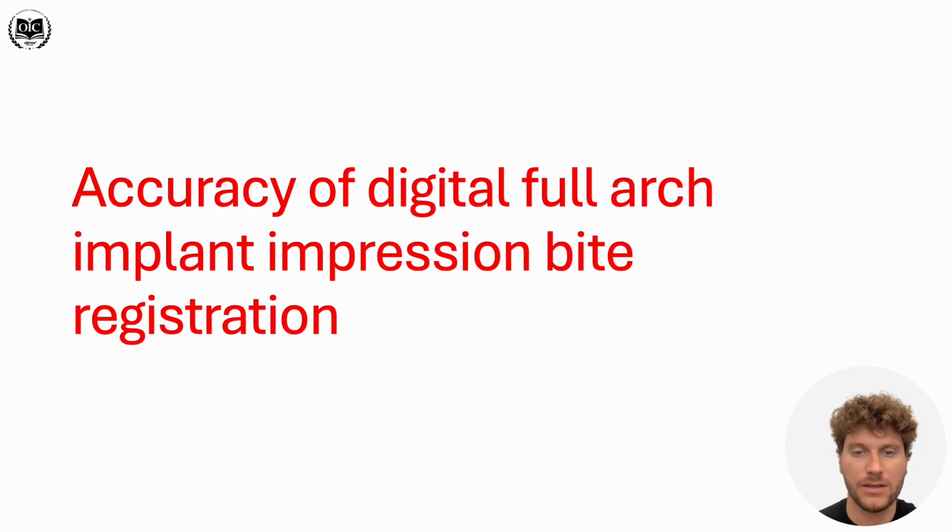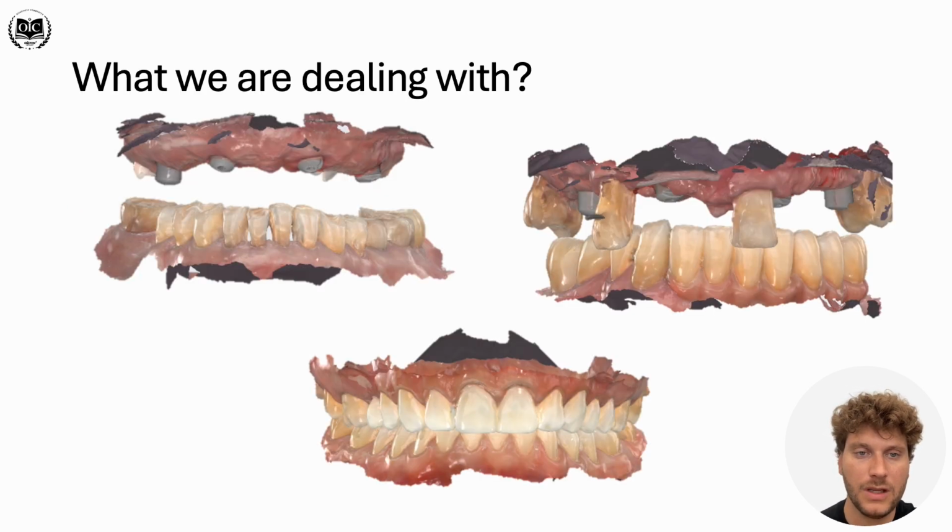For the second part of the lecture, we'll touch upon digital bite registration of these kinds of full arch implant cases. We deal with all sorts of situations in our clinic, ranging from patients that don't have good looking or fitting restorations, either removable or fixed, so we put in implants, scan, and then need to come up with a good looking temporary solution for them in the healing period.